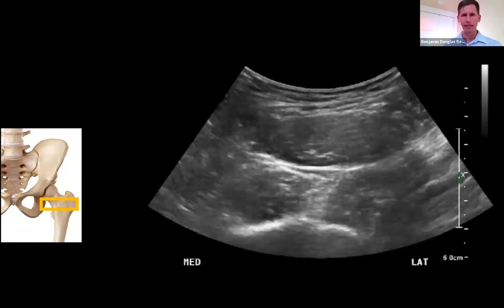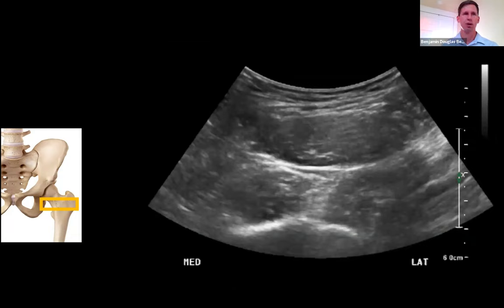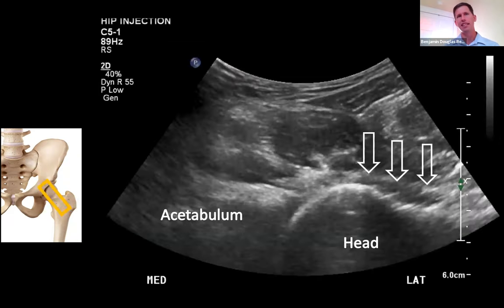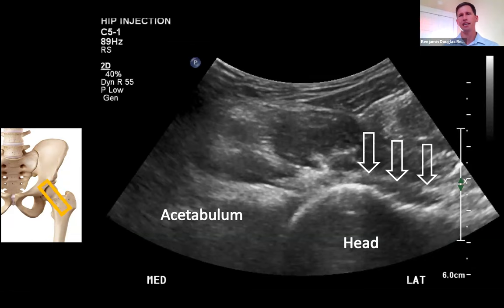As you scan cranially, you'll come across a flattening portion of the femur — a sign you're approaching the femoral neck. Begin to angle your probe more towards the groin, about 30 to 45 degrees. This will bring the acetabulum and head more into view. You can see the acetabulum in the medial portion of the screen, the head of the femur laterally, and the arrows designate the capsule extending over towards the neck.